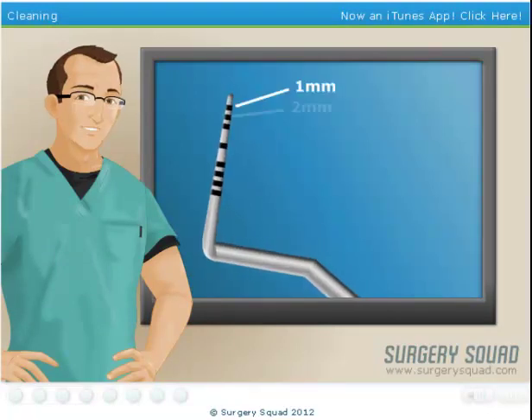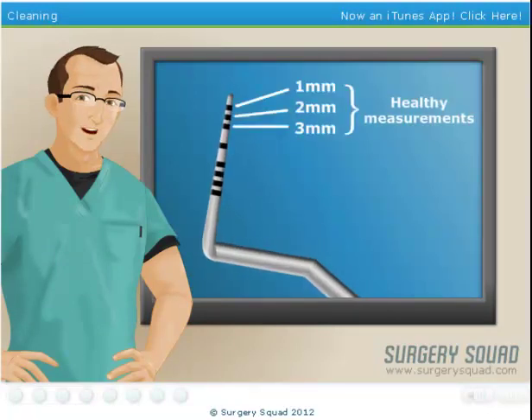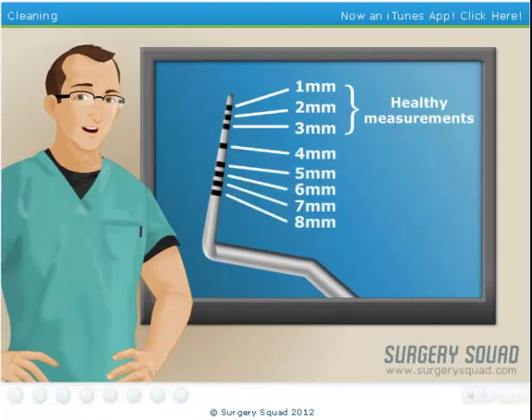Measurements of 1, 2, or 3 millimeters generally signify that our patient's gums are in good health, but measurements of 4 millimeters or more indicate the presence of periodontal disease.